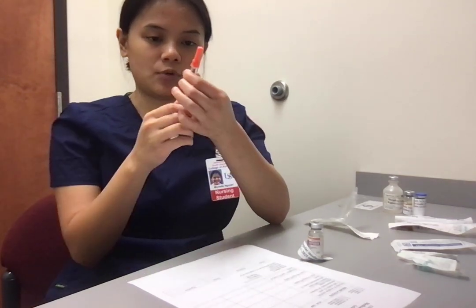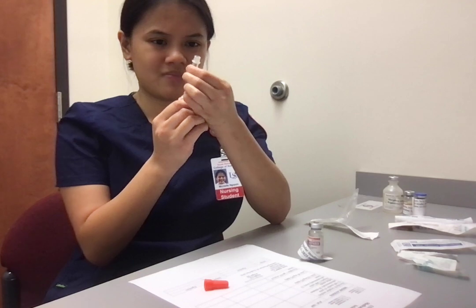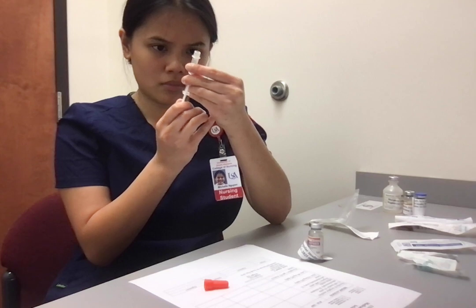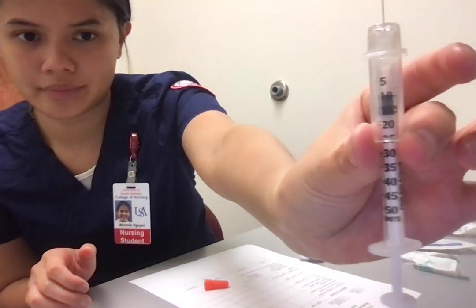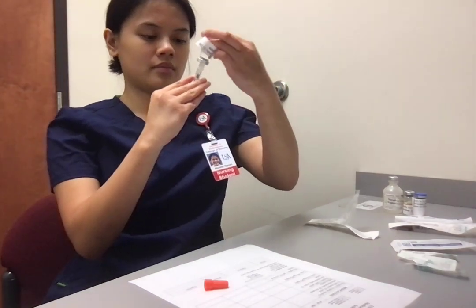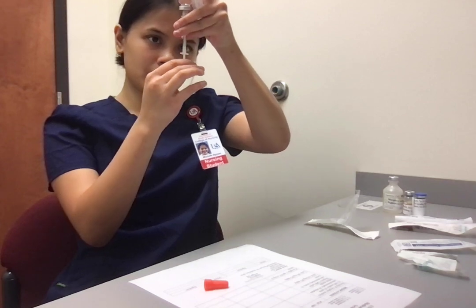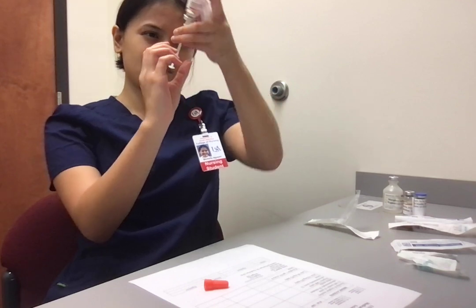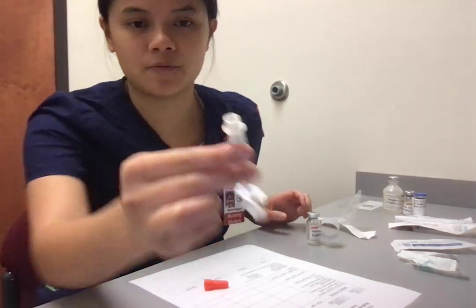Since we need 10 units, I'm going to be injecting 10 units of air. Now I'm going to make sure that there are no air bubbles. So now I have 10 units for my patient.